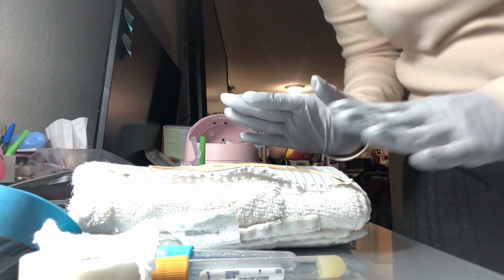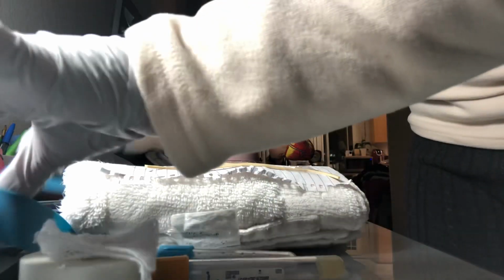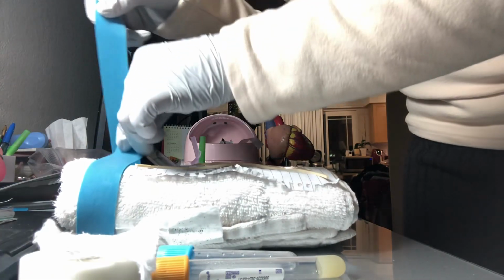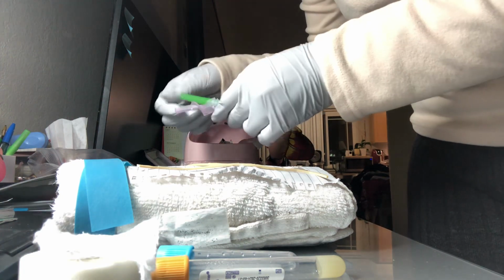So when the site has been dried, I will go ahead and perform the actual blood draw. I will retie the tourniquet, and I'm going to handle the needle.